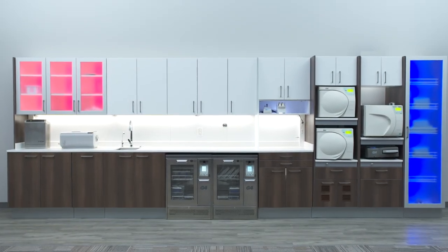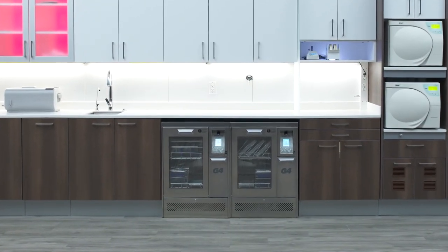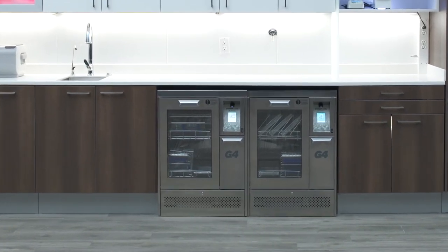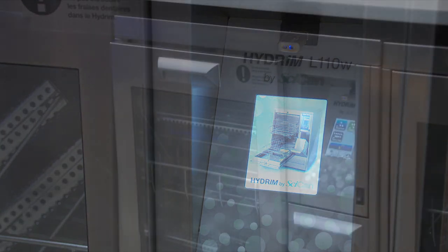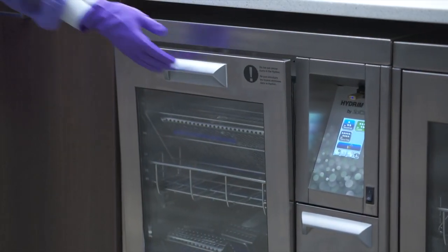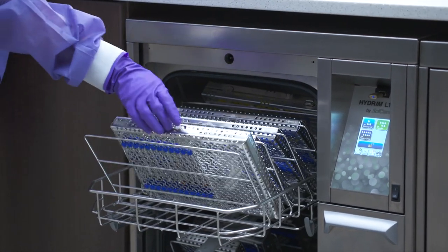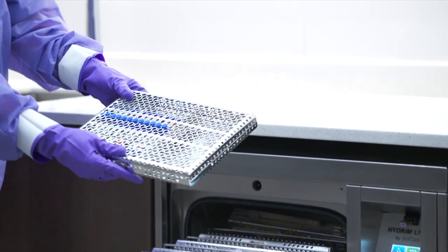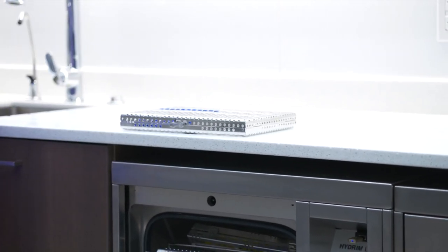Thank you for adding the SciCan Hydrum L110 instrument washer to your practice. This freestanding or under-the-counter automated instrument washer with a responsive 3.5-inch touchscreen provides a safe, effective, and efficient way to clean instruments. The Hydrum L110 is a clinical reprocessing device that minimizes physical handling of contaminated instruments, reducing the risk of sharps injury and creating a safer work environment.